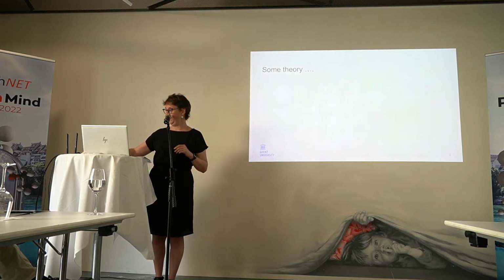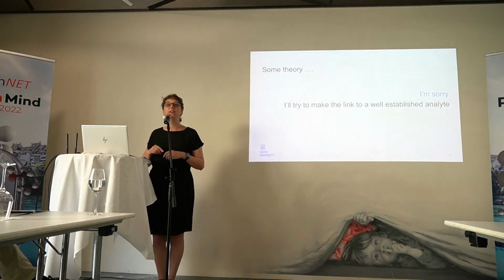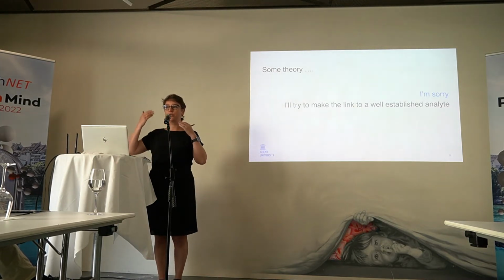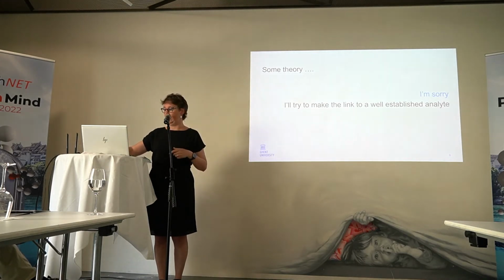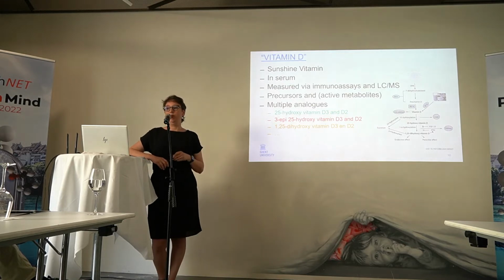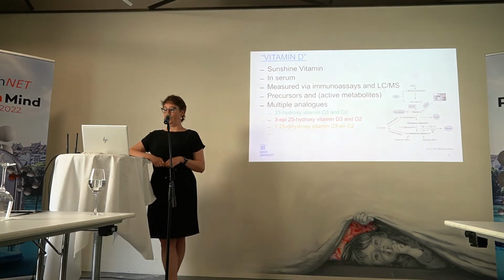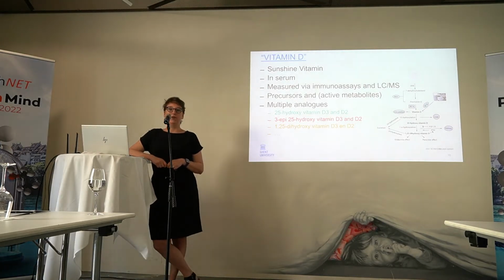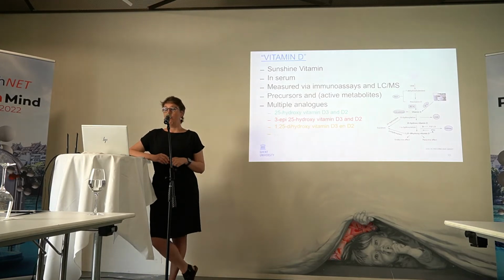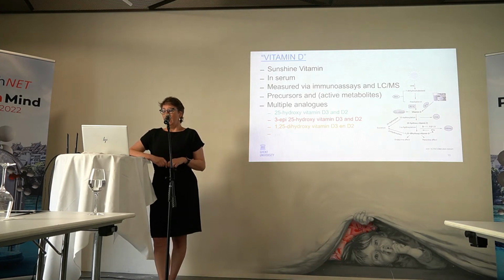So some theory, I'm sorry, and I will try to make the link to a well-established analyte just for you to see the line and maybe have a better understanding. So the analyte that I have chosen was vitamin D. Vitamin D is a sunshine vitamin. We determine it in serum. It's measured via immunoassay and LCMS, and if you refer to vitamin D, you might refer to precursors and active or non-active metabolites.